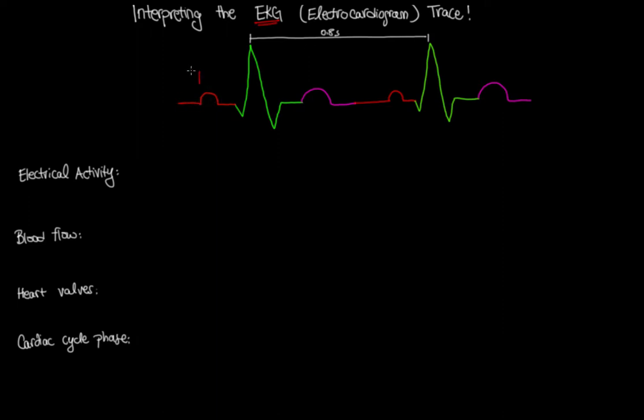What we call the P wave, followed by a big event that is known as the QRS complex, starting with a small downward deflection, Q, followed by a tall, sharp peak, R, and then followed by a final downward deflection, that is the S. And then the third principal deflection is what we call the T wave. And so this is going to be repeated over and over as long as you're recording from the heart. And a typical interval between two R waves is around 0.8 seconds.